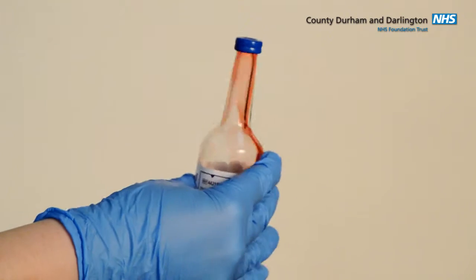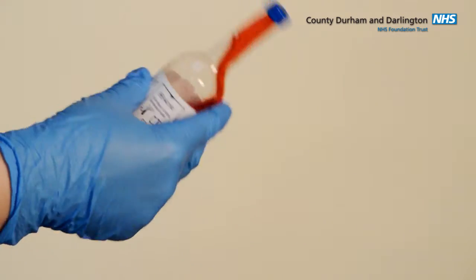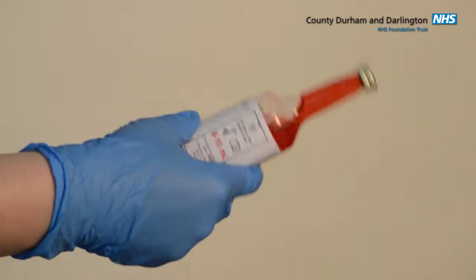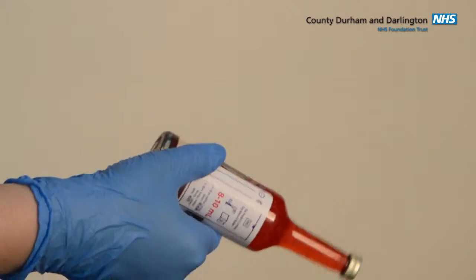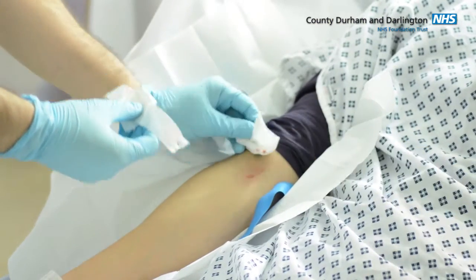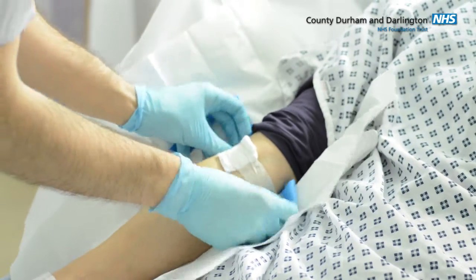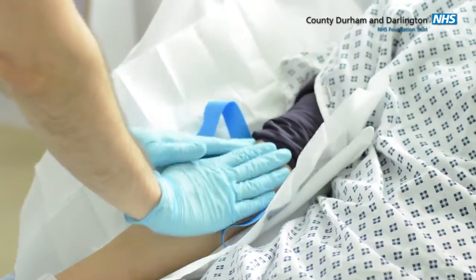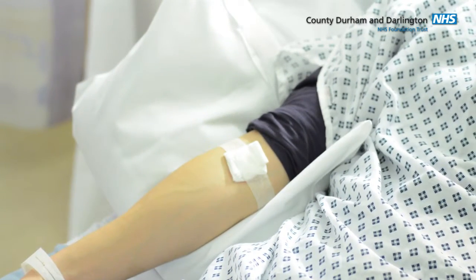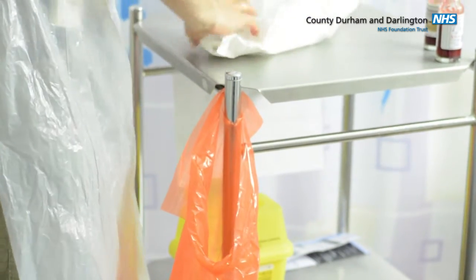Once the blood samples have been collected, slowly agitate the contents inside the bottles. Just remove that. Does it stop bleeding? Yeah. Just going to give you a dressing until it stops fully. Okay. There you go. Just lift your arm. Clear equipment in the clinical waste bin and wash your hands.